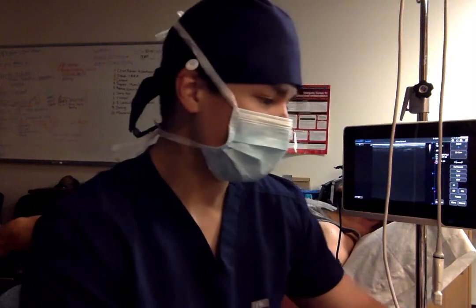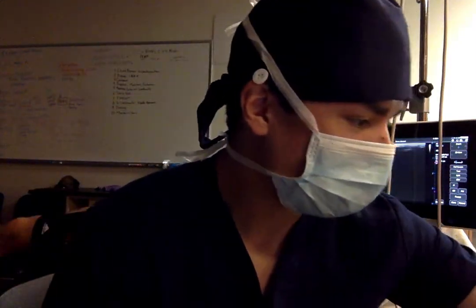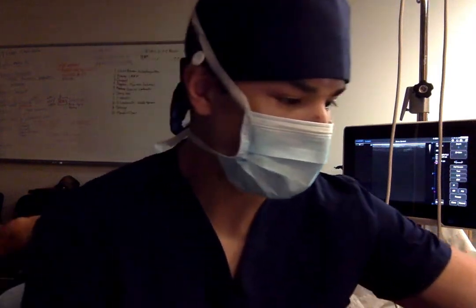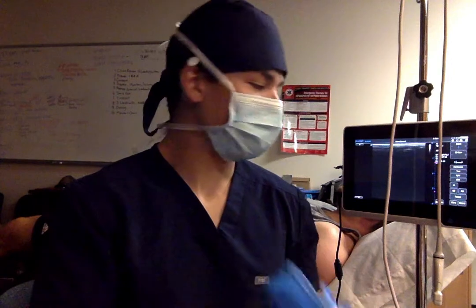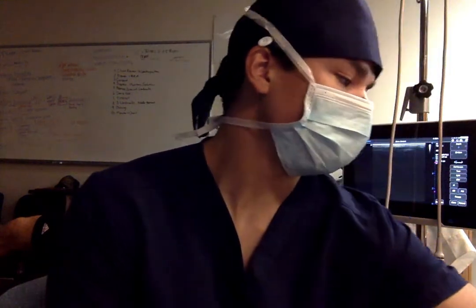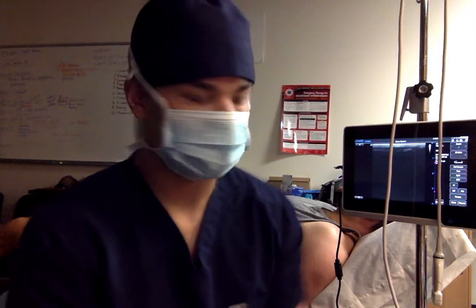I'm going to grab my sedation meds. I'm going to do 2 milligrams of Versed and 30 milligrams of ketamine. I'm going to grab 0.5% ropivacaine. Going to be doing 15 cc's on each side, and my sterile gloves, my ultrasound probe cover, ultrasound probe, and prep. So I gathered all, and I'm going to grab an assistant to help me out with this, and of course my ultrasound. So go back into the room.